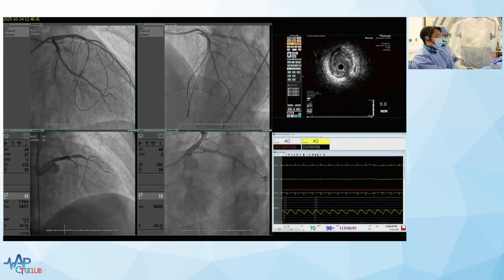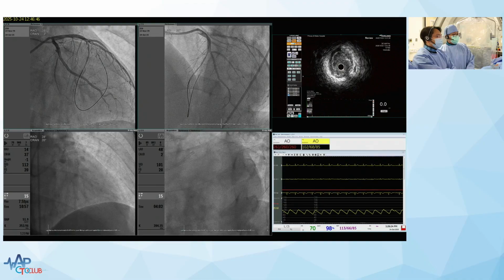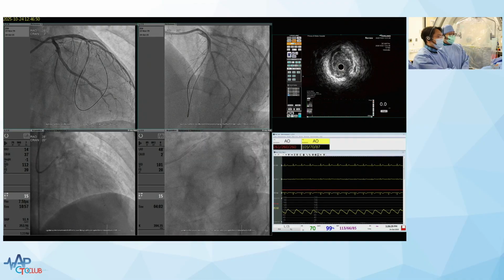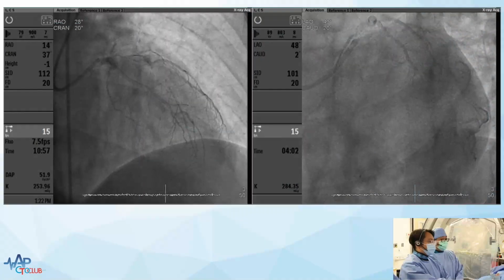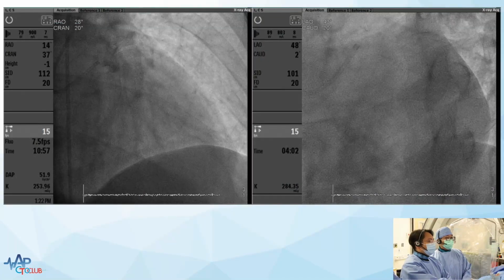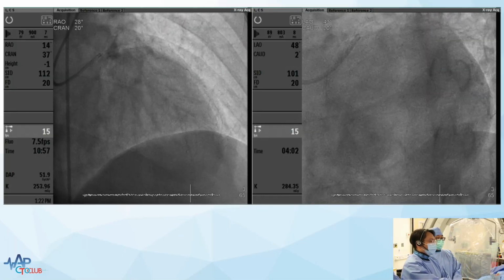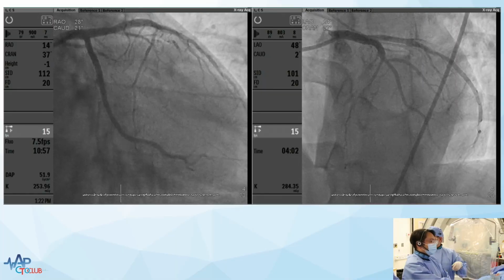So here comes the left coronary angiogram. And you see that the CTO segment is right after the mid LAD in the distal LAD segment, with a very juicy septal-septal collateral supplying the distal LAD. And from the spider view, the circumflex stenting for that CTO lesion is very nice. So should we have some discussion before we go on?